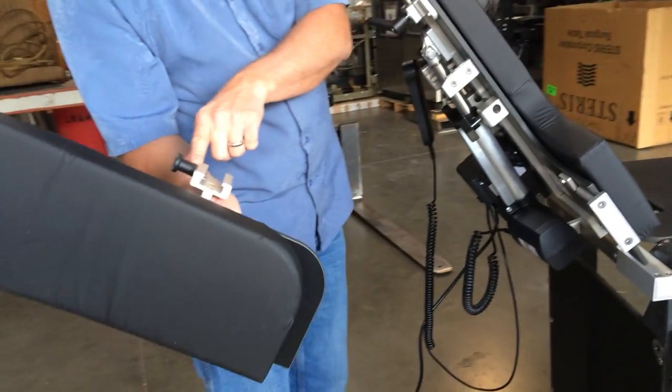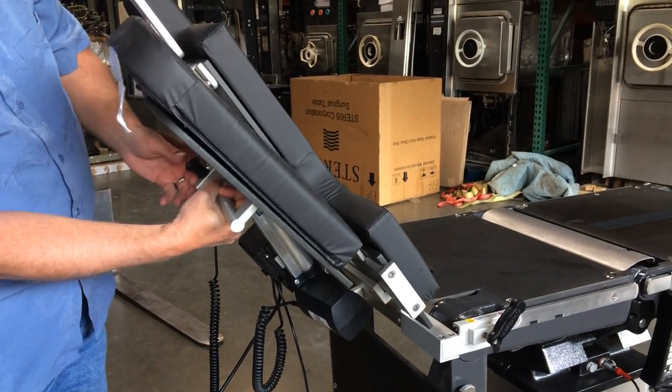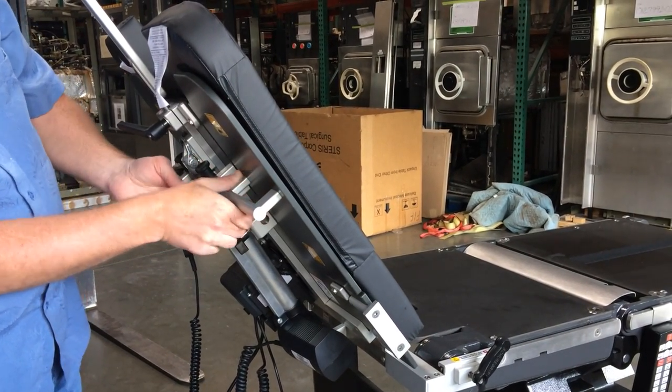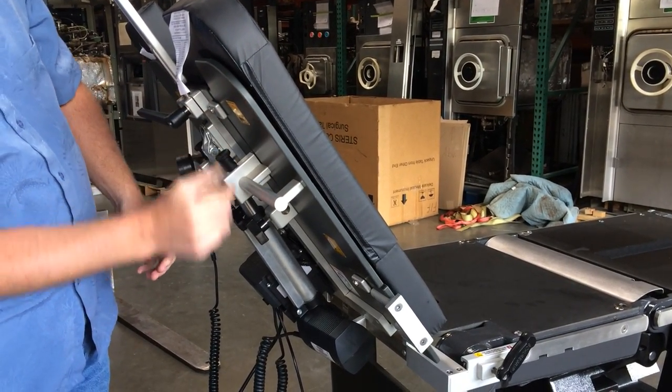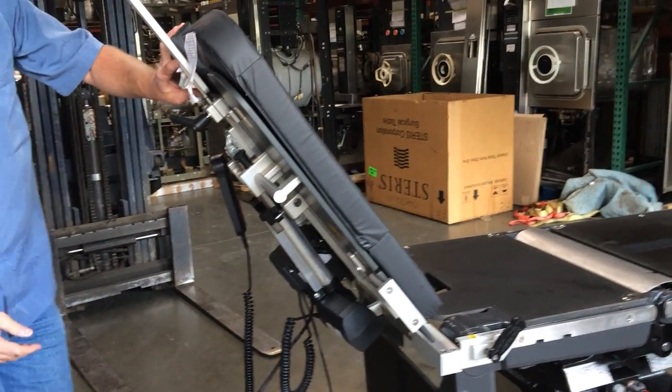So there's a little socket here. The pin releases it so that socket comes right up on here. Just slide that on up and put it in place. It locks in place here with the detent, and also here. Same thing goes for the other side — just got two detents.